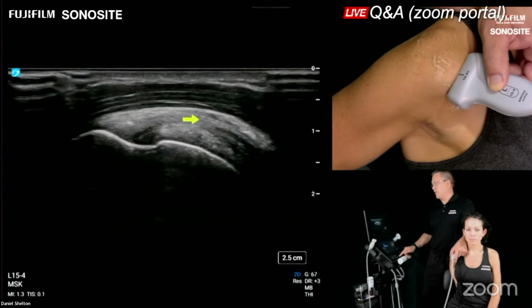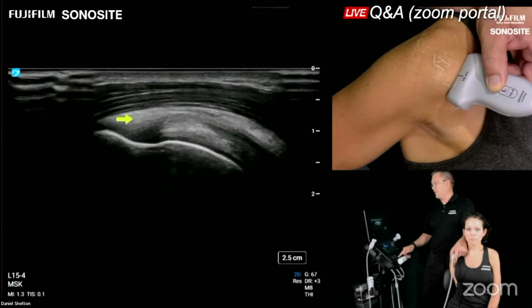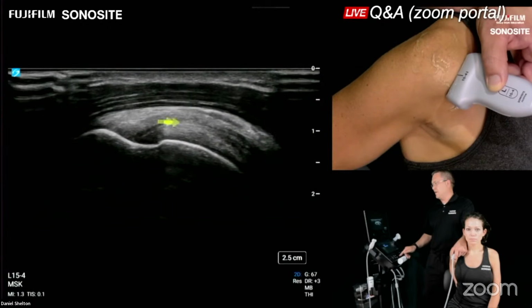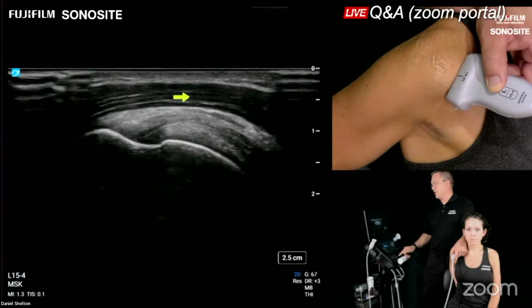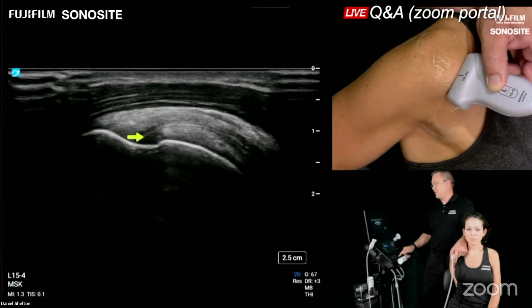And what fills that void is the overlying subacromial subdeltoid bursa. So when that happens, we get this big dip. We no longer get this parrot's beak looking bill, and we get this big flattened supraspinatus tendon. And a lot of times the deltoid will just sit on the greater tuberosity. So this I'm already suspecting to be artifact.